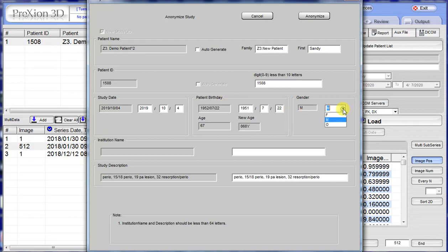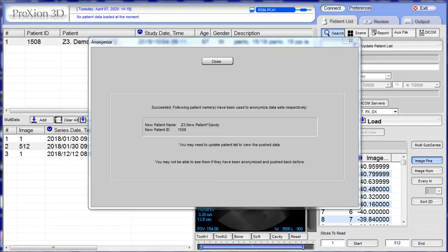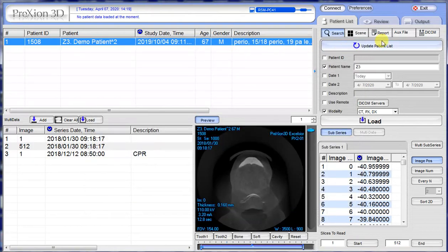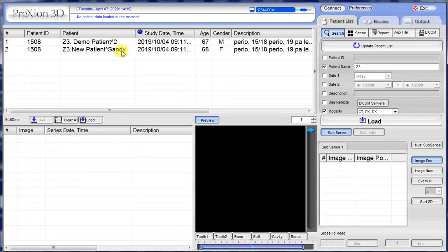Let's say we made a mistake and it's really a female, so we can change that. Once you've got your changes, click the Anonymize tab. Give this about a minute. When it's complete, hit the Close tab. Then hit Update List, because that is the refresh button. Now you have your new patient displayed.